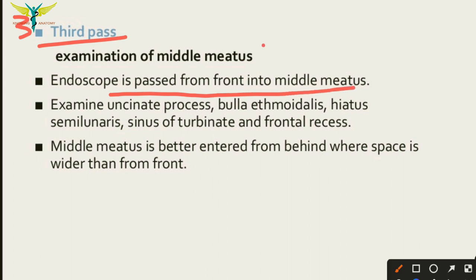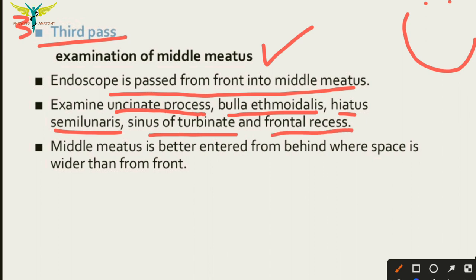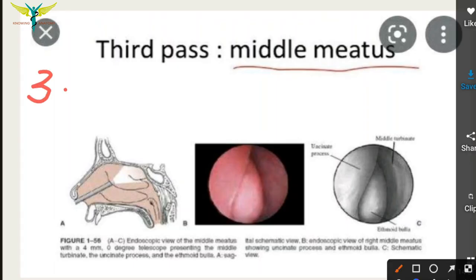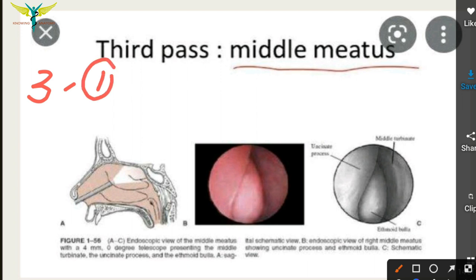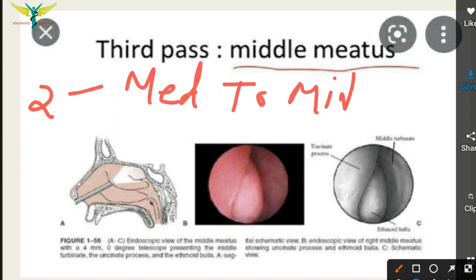In the third pass, the endoscope is passed from the front into the middle meatus. In the middle meatus, we examine many structures: the uncinate process, bulla ethmoidalis, hiatus semilunaris, sinus of the turbinate, and the frontal recess. All these structures are found in the middle meatus. Remember: in the first pass, the endoscope passes along the floor of the nasal cavity; in the second pass, medially to the middle turbinate.